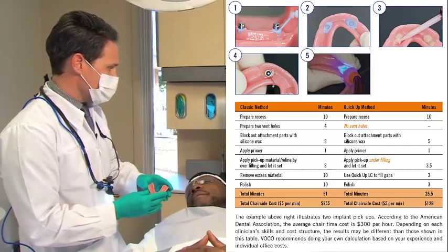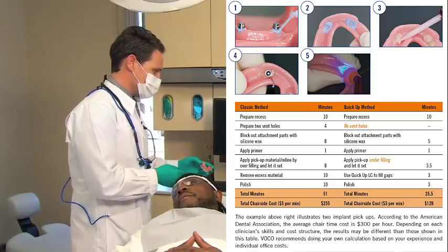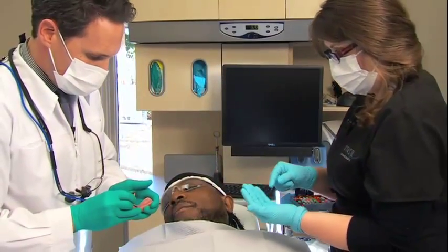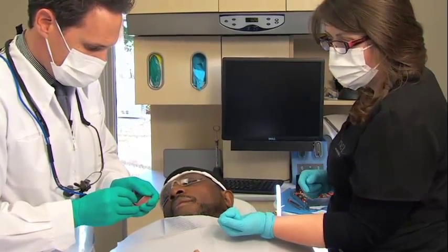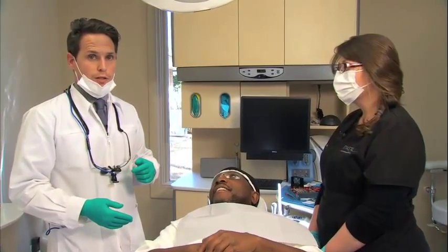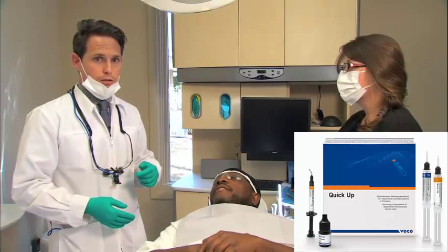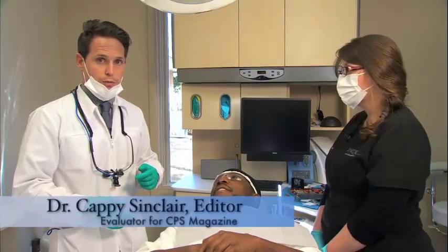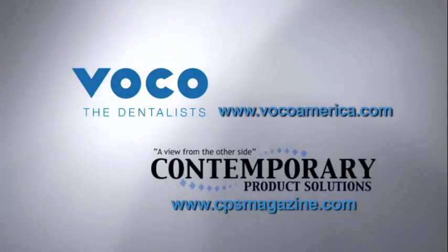We're going to swap in the locator attachments — I'll pop off these housings and the new ones just pop right in. The great thing is you'll definitely know it's seated because it will snap for you. We had a great product result here. The best thing about VOCO is they've created a nice all-inclusive package from start to finish to attach these implant denture attachments in a very rapid time. The cleanup is great, the patient is very satisfied. For more information, head to their website at VocoAmerica.com.